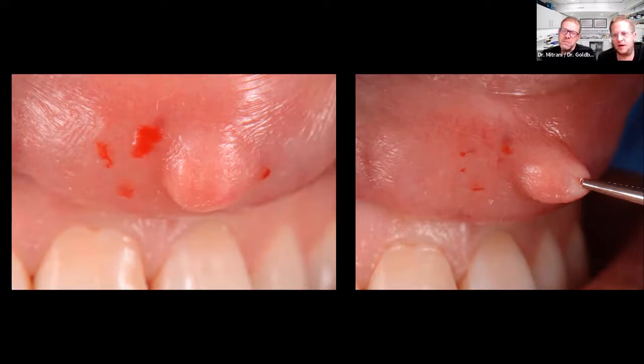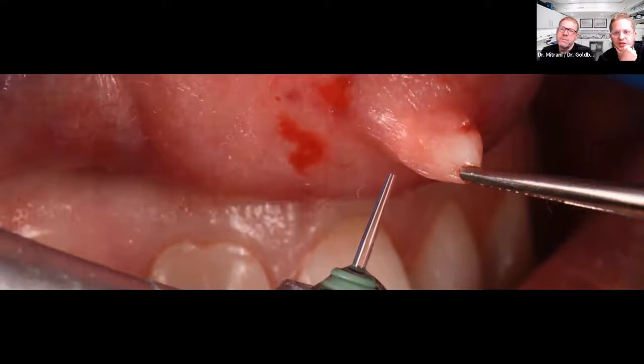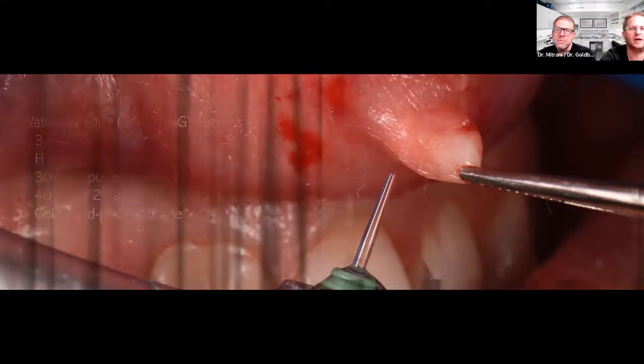We've done it also with just topical anesthesia. Here we did some infiltration, but now more and more we're using topical, because one of the beauties about laser is that as it's working its way through the tissue, if you use the parameters correctly, it's not that painful. So we can do it also with topical. So here we're localizing the lesion, and here we're using an MT4 sapphire tip, which gives you a very, very clean cut. It's almost like a 15C blade.